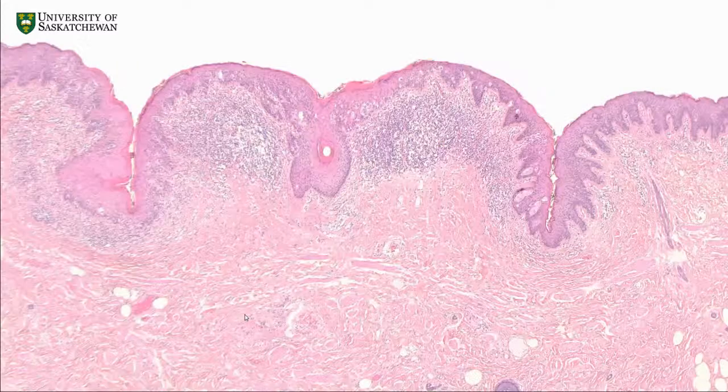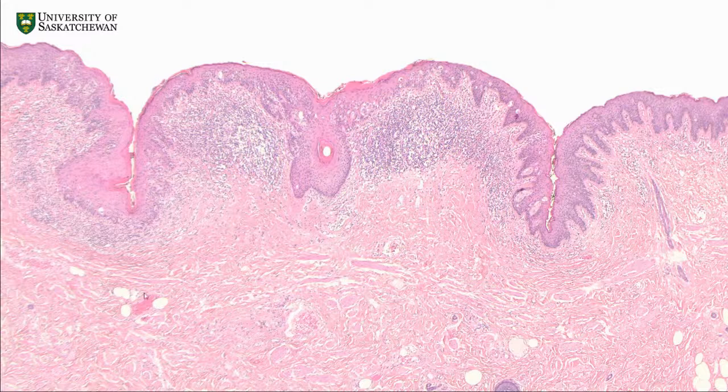Here's a surgical excision of extramammary Paget's, where you can see it's inciting a very florid lichenoid reaction to it. And even at this low power, you can appreciate on the basal and parabasal layer some Pagetoid type of spread of these clearing-like cells, and that some of them have this voluminous type of pale pink cytoplasm. And here it's really well illustrated without having all of the inflammation surrounding it.